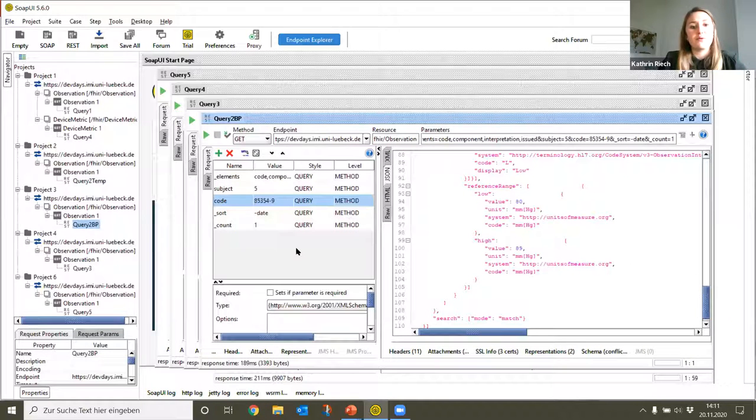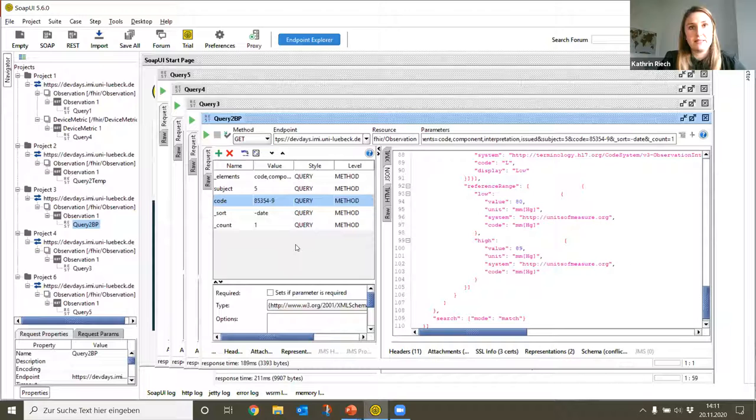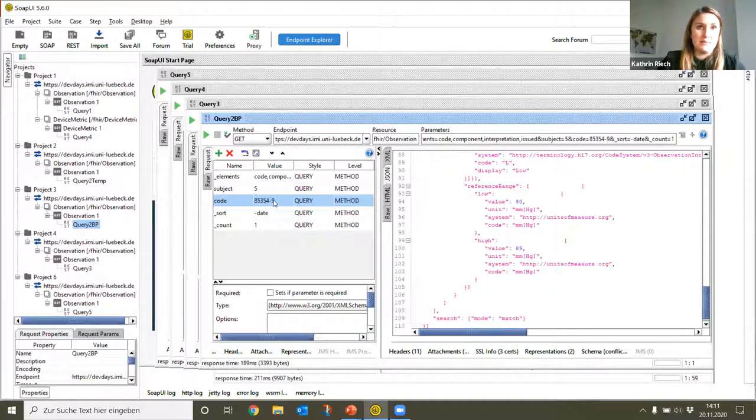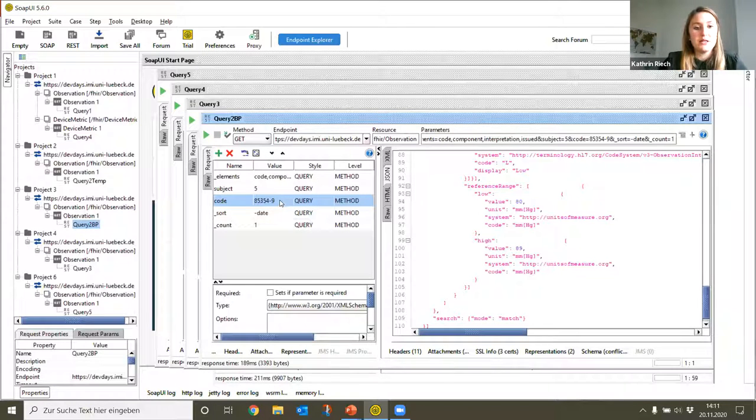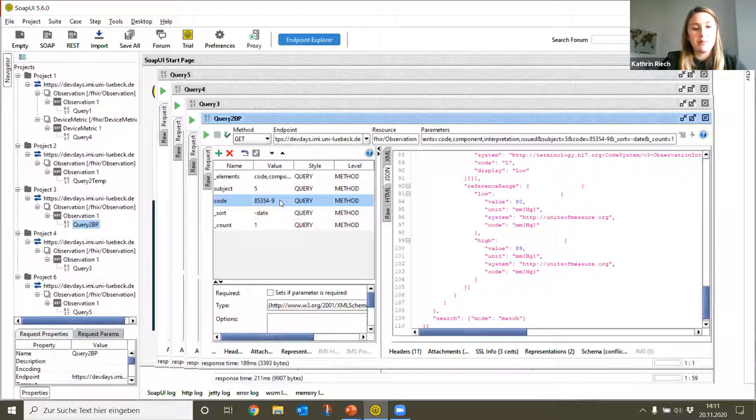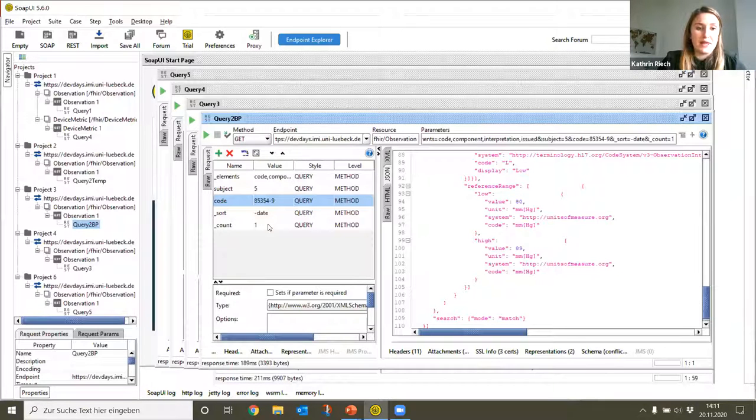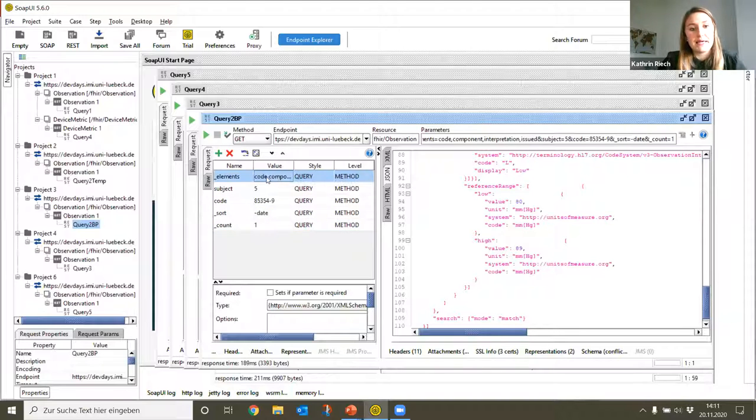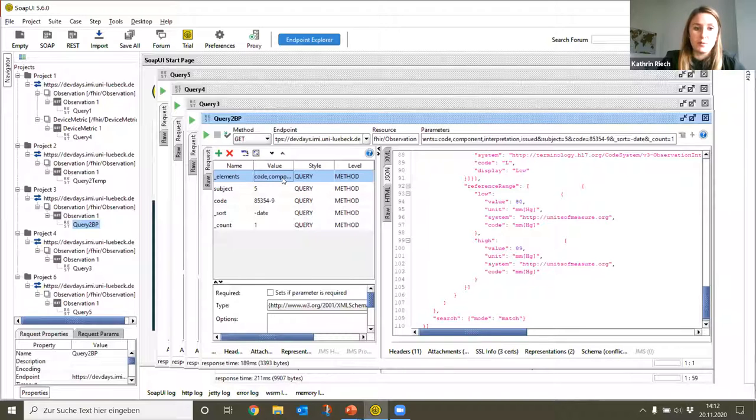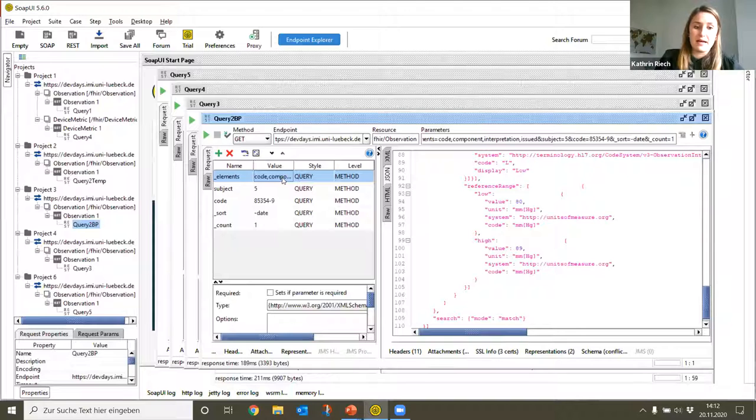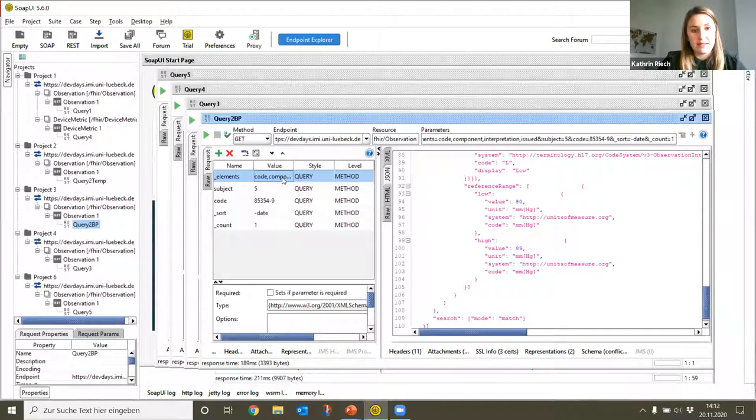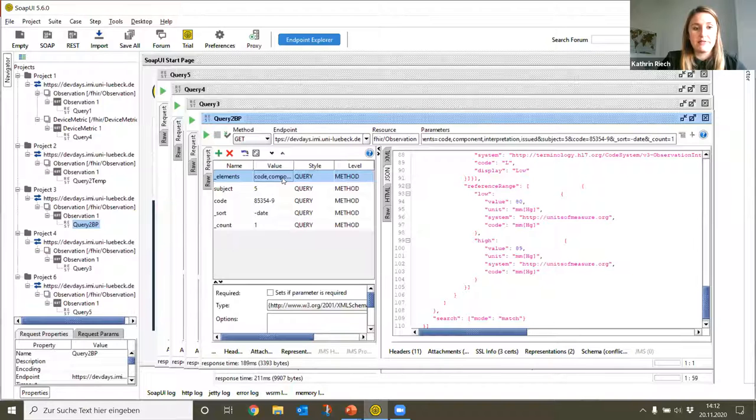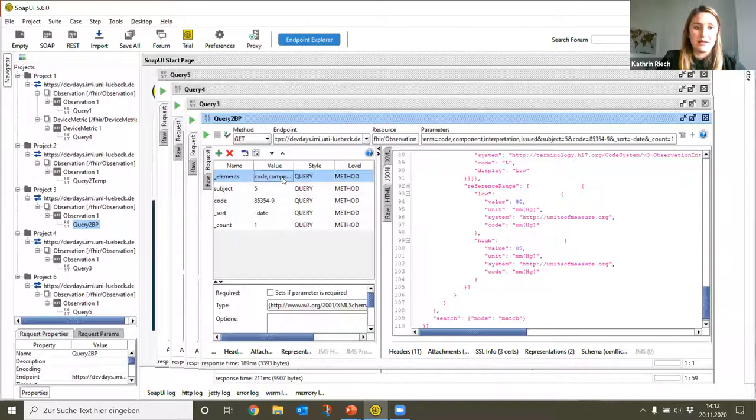For the blood pressure measurements we have a very similar query. We just modify the LOINC code and adjust it to the blood pressure measurements. We specify that in this case we only want to see one result. In the elements here it is important that we show the component attribute. This is specified in the Vital Signs profile, that the blood pressure has a systolic and diastolic value, and these can be shown in several components.